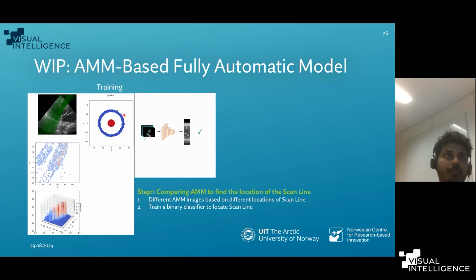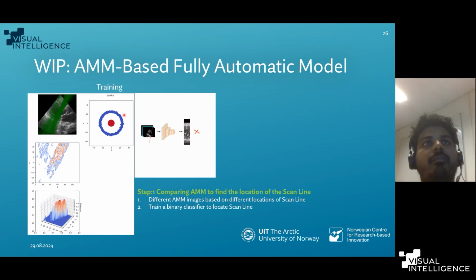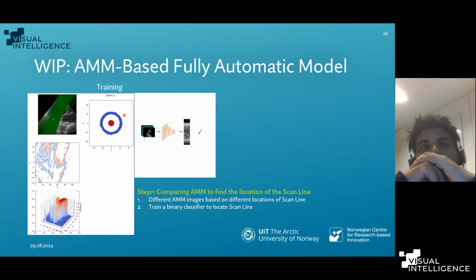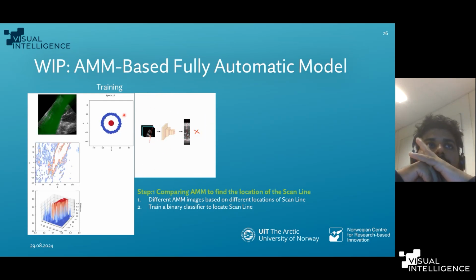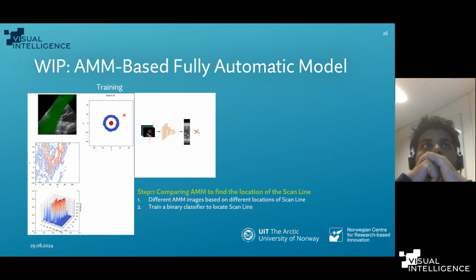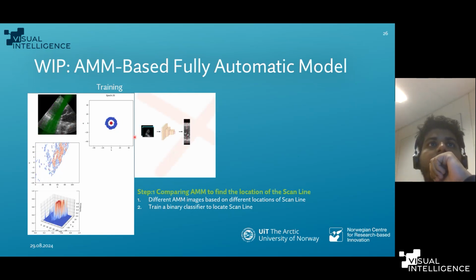The previous work that I did is a semi-automatic left ventricle measurement model using the same architecture, and it solves the overestimation and underestimation of the B mode approaches, because we do the landmark prediction on a constrained straight line.